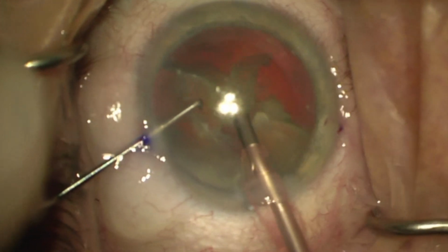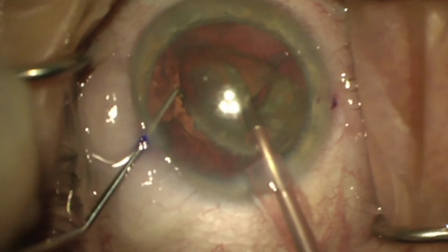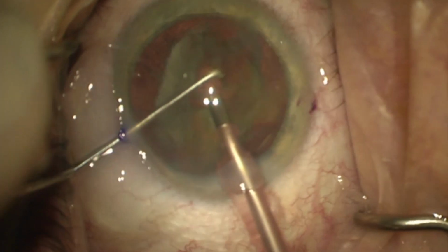In a nuclear grade 3 cataract at least, vertical chopping works so well for these hard lenses.